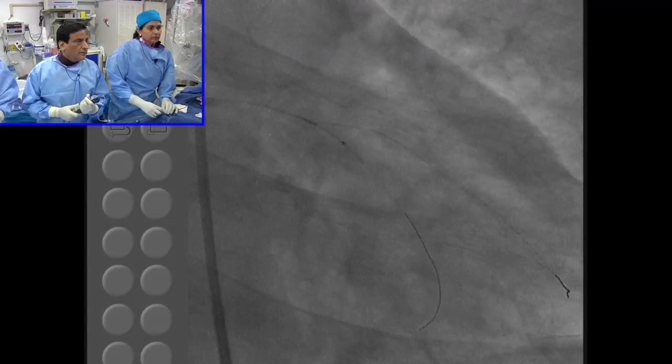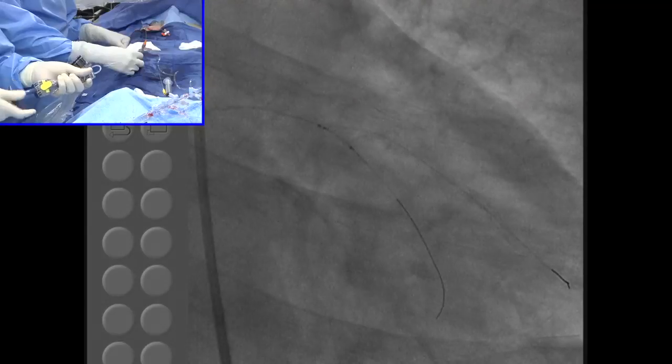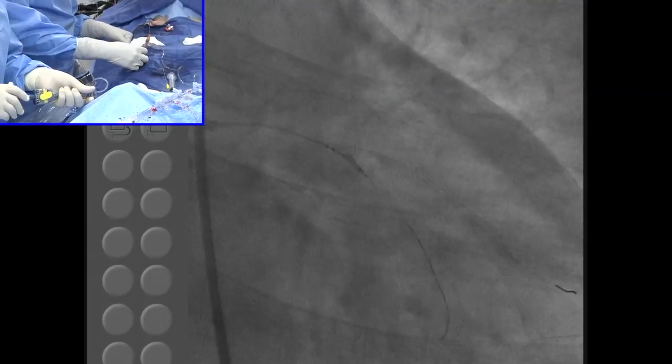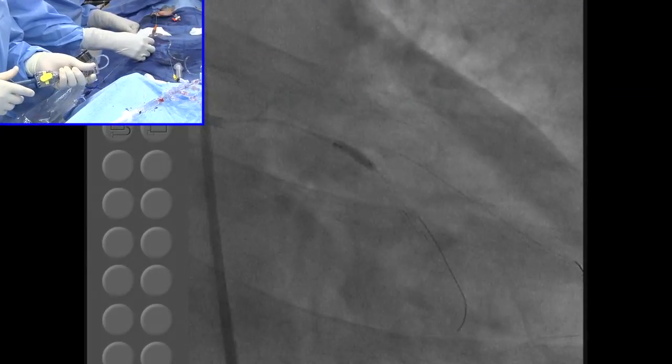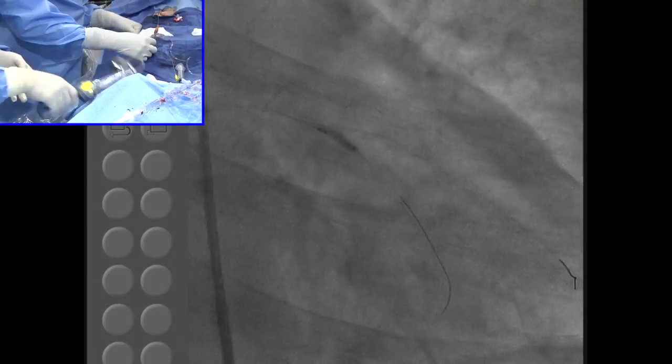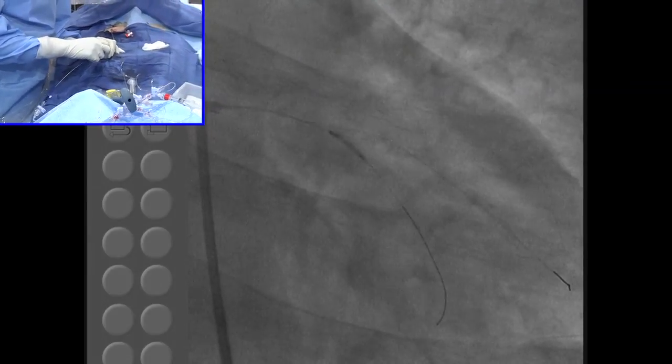Go one more. Okay. This is 10, so you can take a 12, right? Yep. Don't go more than 12. This is the 10 millimeter length. 12. Okay, get us a 2.5 by 38 and a 2.5 by 12.